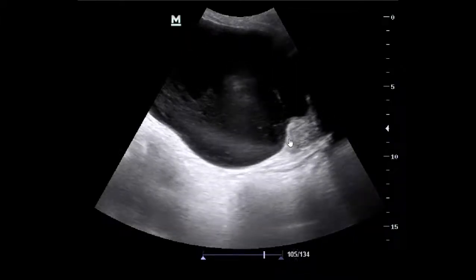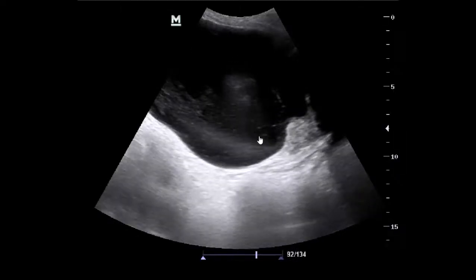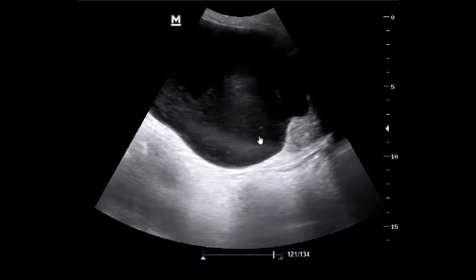It's prominent here, and there is almost turbid urine as well. That means our patient has an obstructive element in his acute deterioration of renal function, and he may definitely have a urinary tract infection because of this turbid urine.